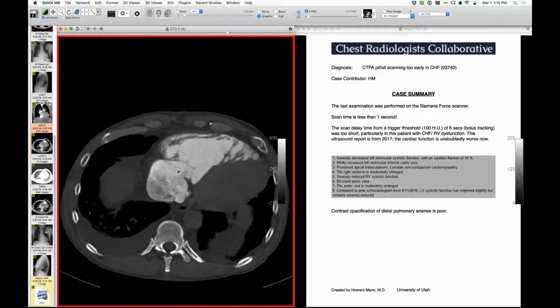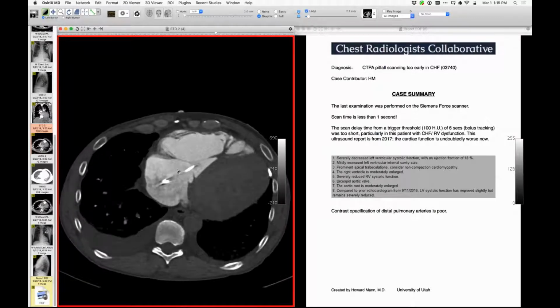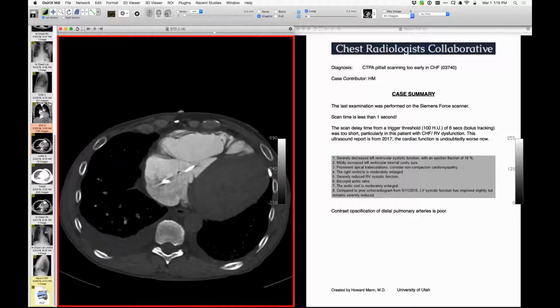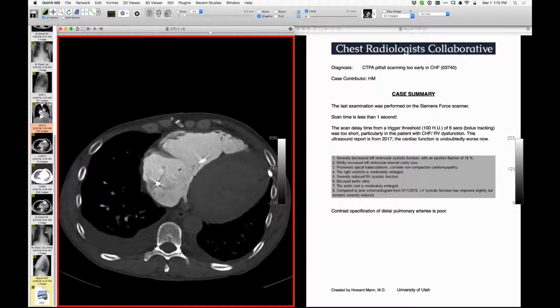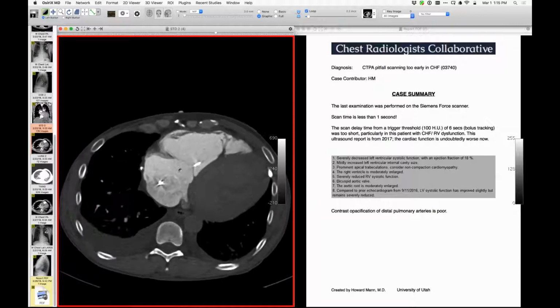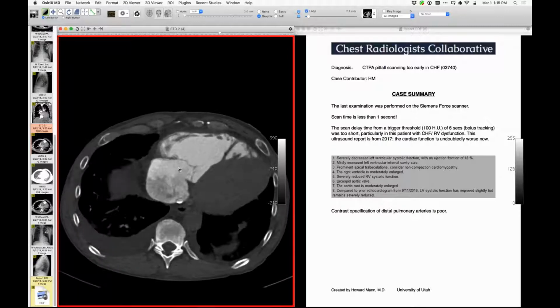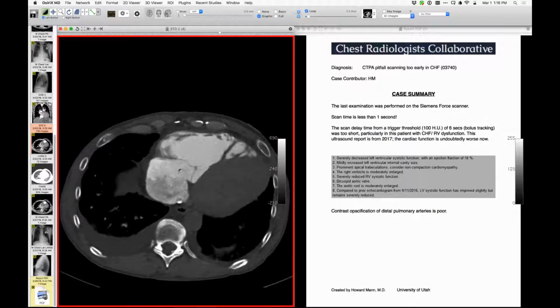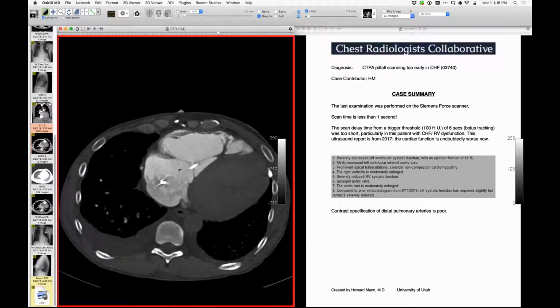And how big is the detector in this thing? Is it 30 centimeters long or something like that? It must be an area detector. Yeah. So this is a detector that has 96 detectors compared to the 64. We just have Siemens equipment. So we've gone from multi-detector 64 to 96. But I can tell you for a scan like this that the table speed, the feed in, is 48.5 centimeters a second. That's quick. And you can actually go to what they call turbo flash, which is like 73 or so centimeters per second table feed. That's really quick. I think that's two Gs. So that's really quick. Right.